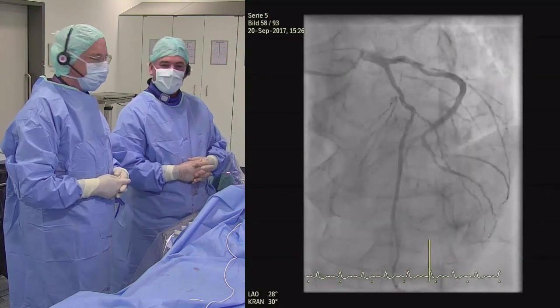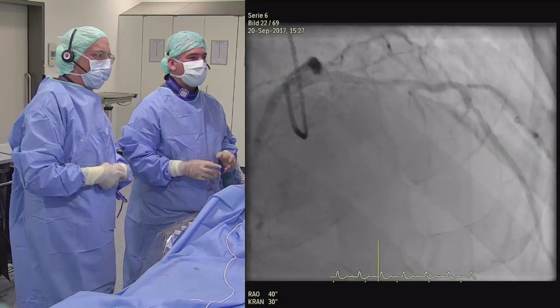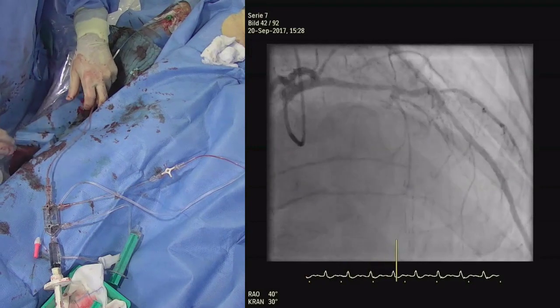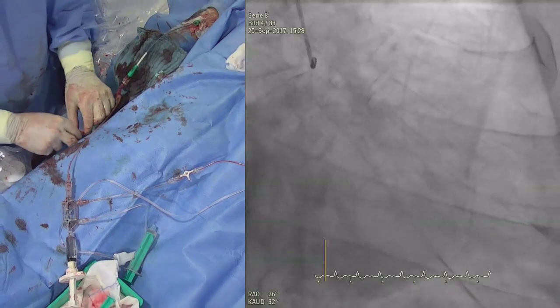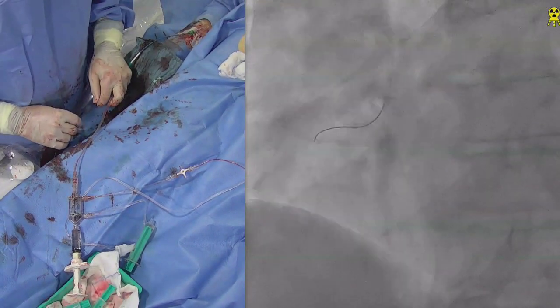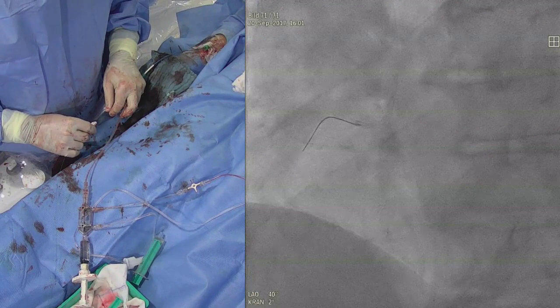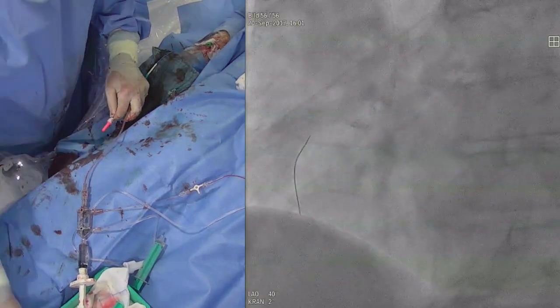So, if there are no further questions, I will try to pull down the wire. We've had them equalized already. Can we see the live angio? Okay, thank you. We'll watch how that tip navigates that hairpin or S-curve. There you go, it just jumped across.